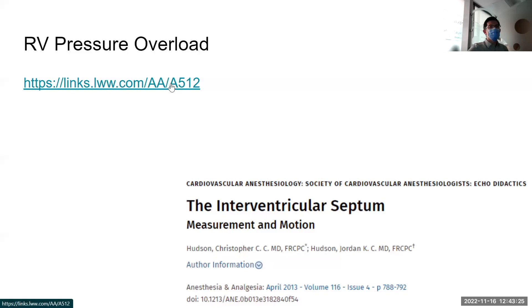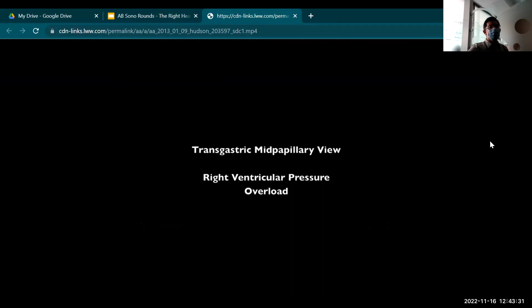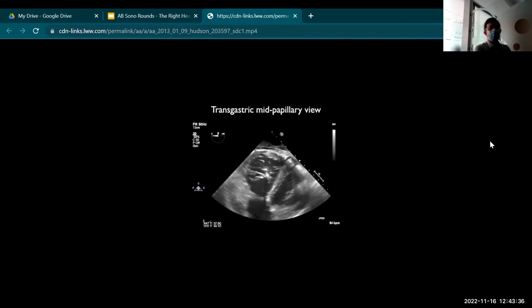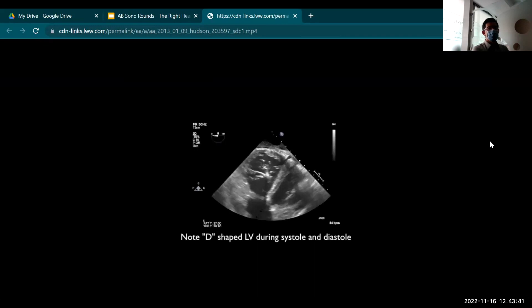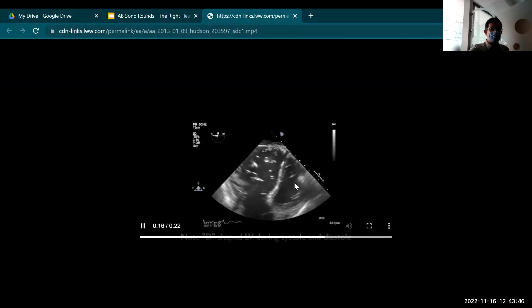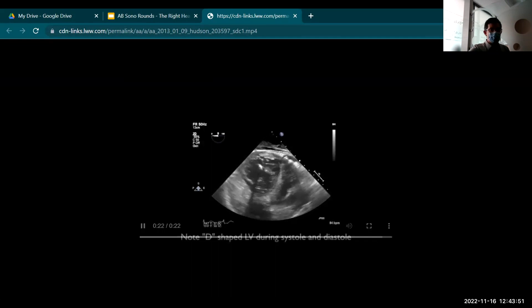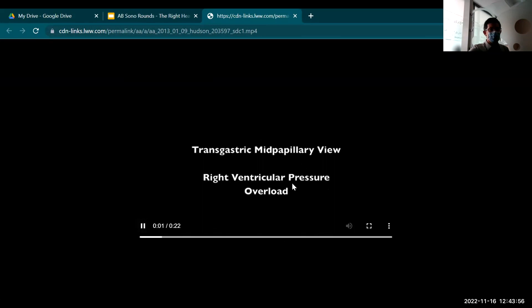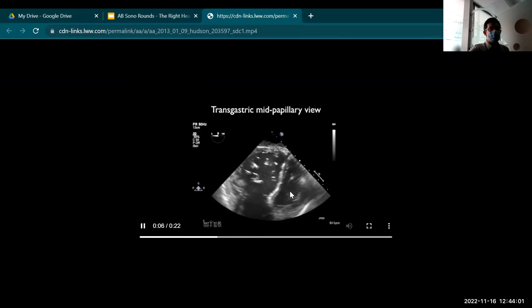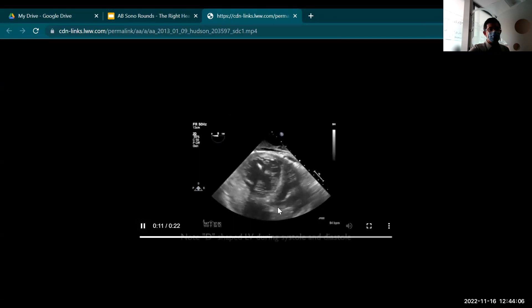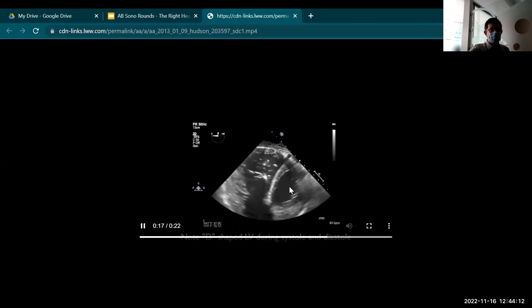Whereas in RV pressure overload, it is flattened in systole — very D-shaped in systole. From the guidelines: in RV volume overload, the interventricular septum is rounded at end-systole and flat in diastole. RV volume overload is septal flattening in diastole.